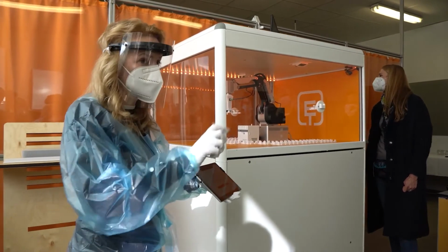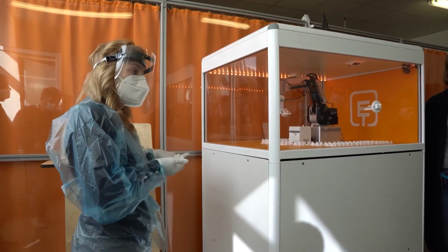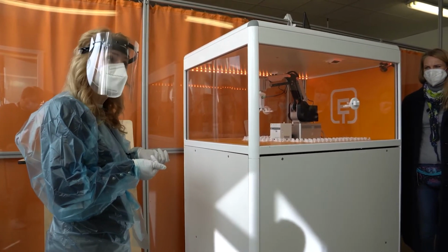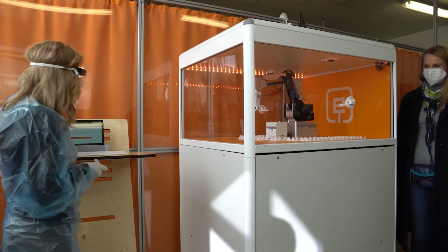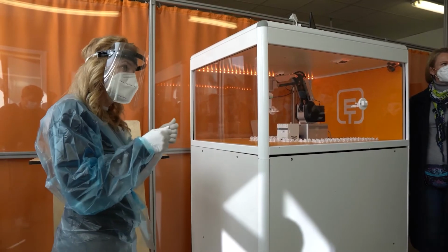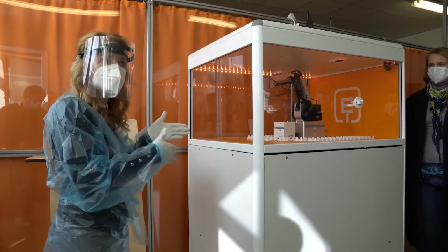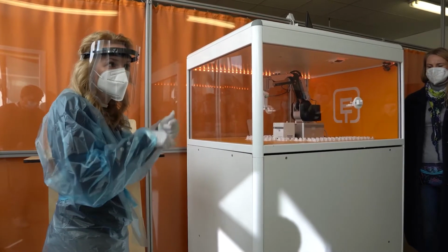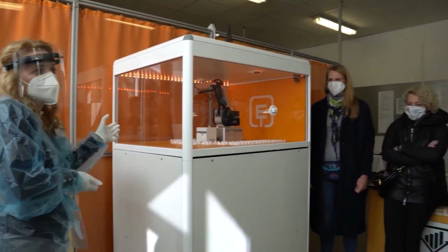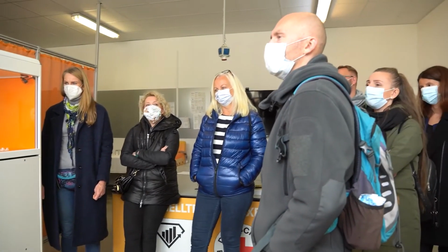So it's very easy, it's bound to the system. And you can bind it to a special app to make a digital European certificate. Yes, of course. You get the option here. You can accept this option, and you will receive a QR code that you can scan on your CovPass app. Just a test certificate, and you will read it, and you get this certificate digitally. Also valid for all of Europe.